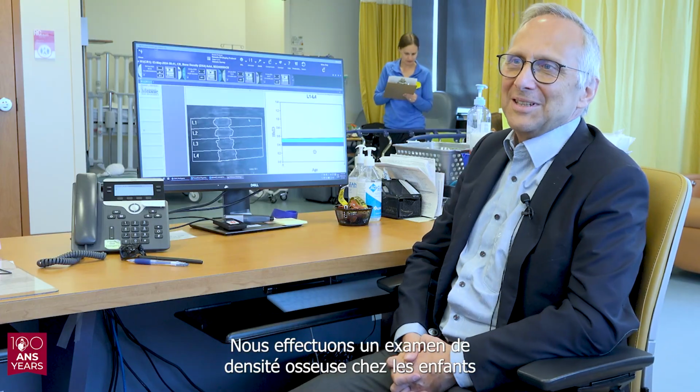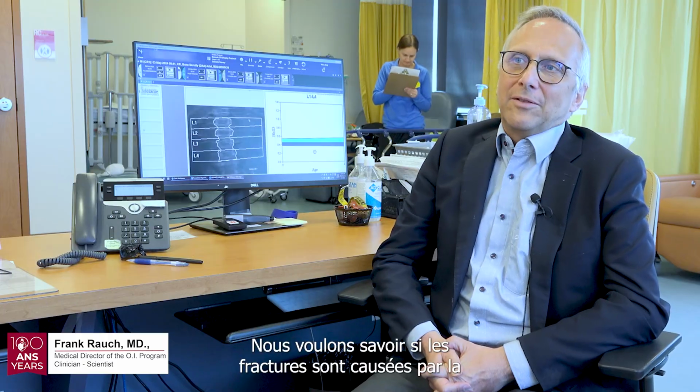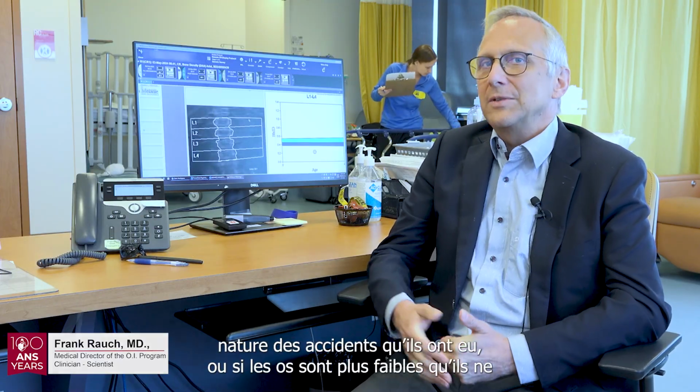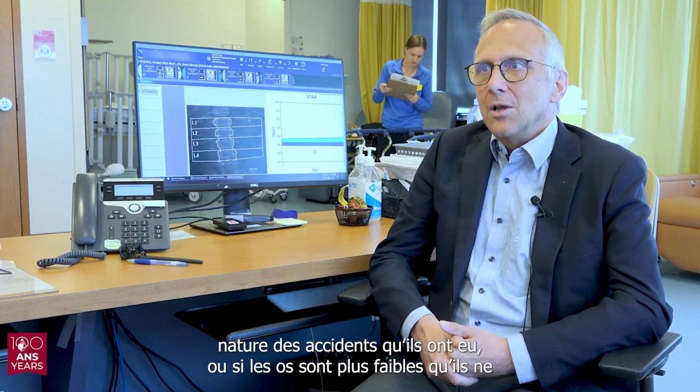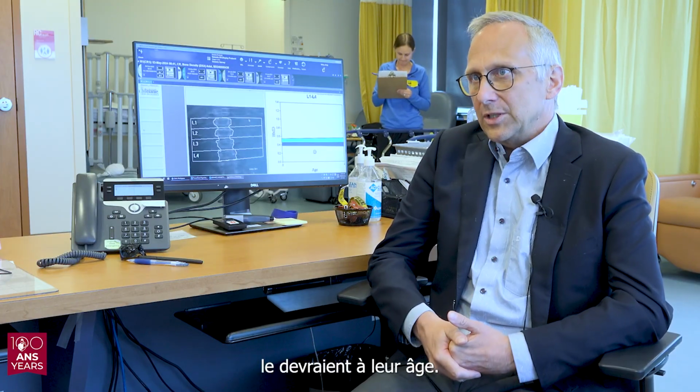We do the bone density in children who have fractures, and so we want to know whether the fractures are caused just by the nature of the accidents that they may have had, or whether the bones are weaker than they should be for the age of the child.